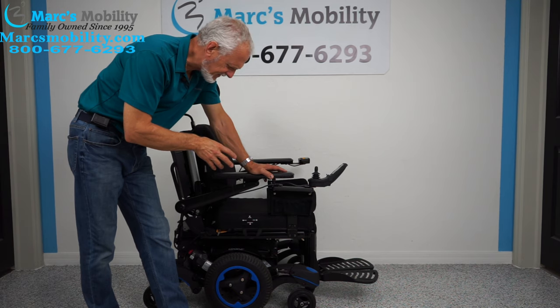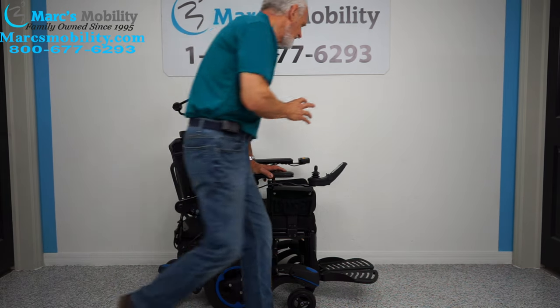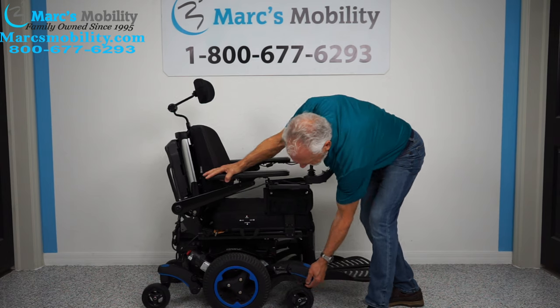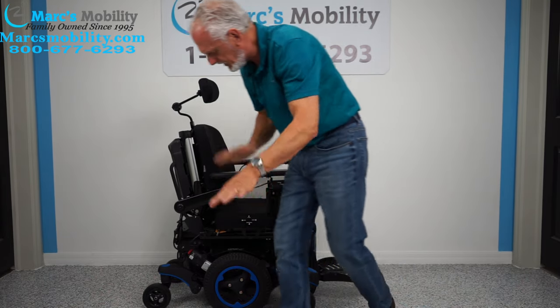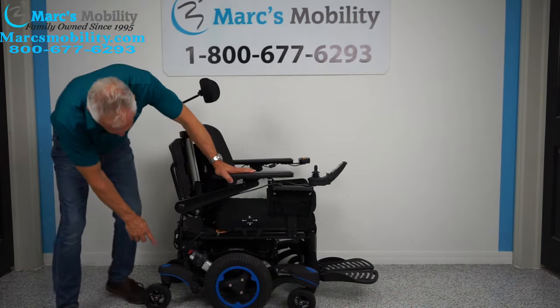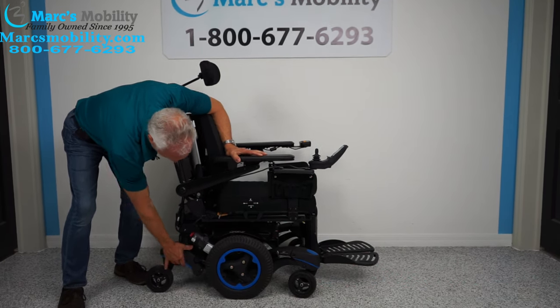This chair has six wheels on the ground. It has spider track suspension, so the suspension is fantastic. You can see how the front wheel comes up, and all four casters are individually suspended.